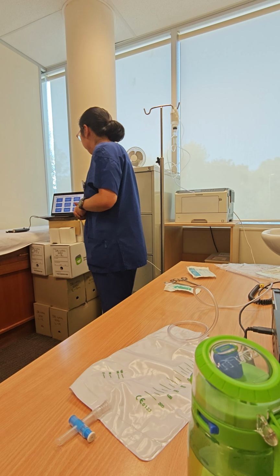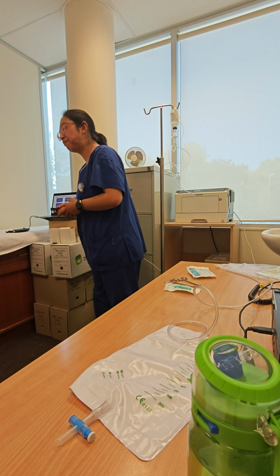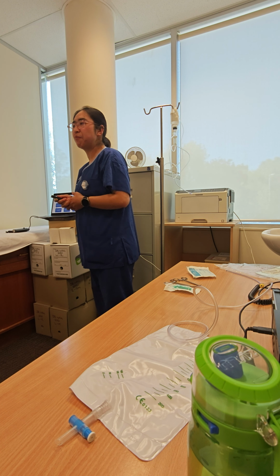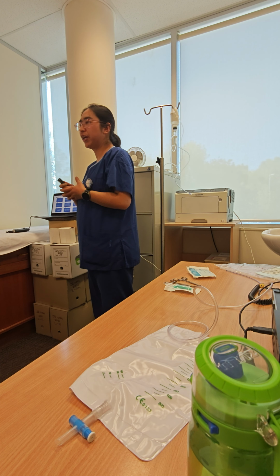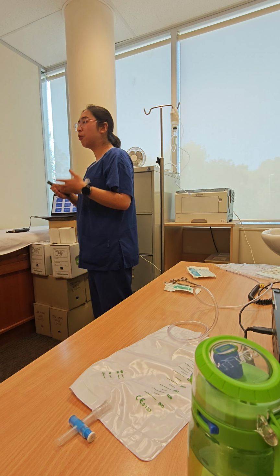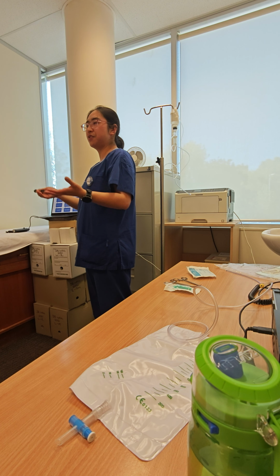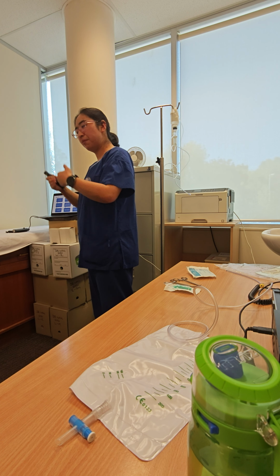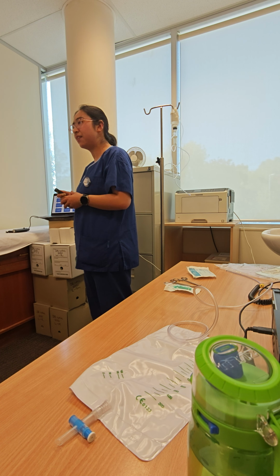What are we going to do next? We're going to go back and check the medical history of the patient. For the first time, we only have the referral from the surgeon. That's all the information we get. We go through the referral and we see this patient just had a post-prostate surgery. That's the reason he comes here. We're going to check if there is any leak in his bladder.